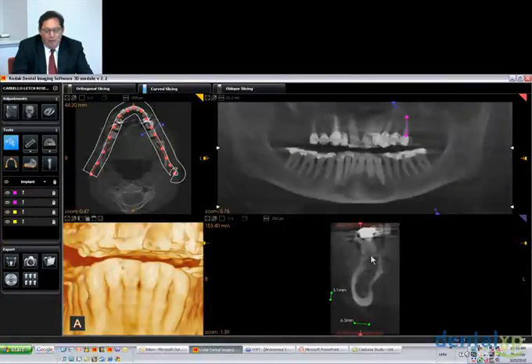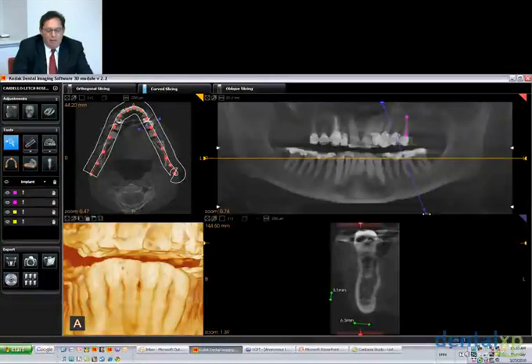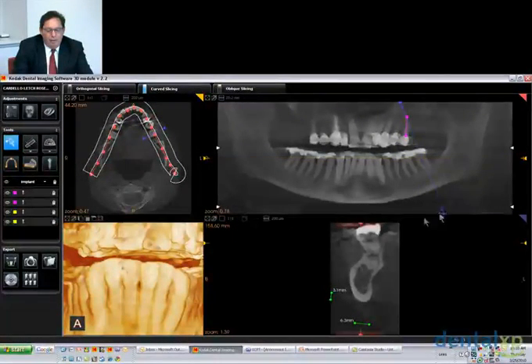Do you see how high the bone is right here? Now I'm going to back up and watch this spot drop. There we go. So here it goes. Now I'll roll through this for you. And that's essentially showing what a furcation involvement looks like. And the next tooth, you see how high the bone is right here? See how high this is? Now you see how low this is? This is demonstrating furcation involvement, which is normally very difficult to see. I haven't been able to see it on other CT software. It's just not that accurate, or it's not that friendly to look through.